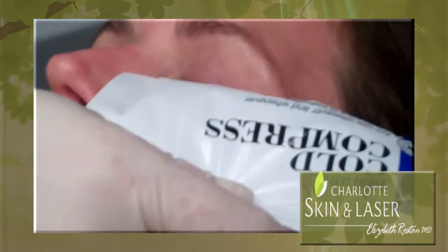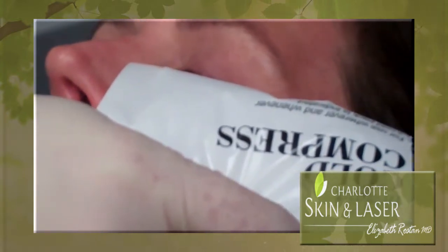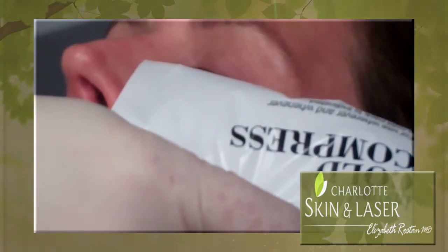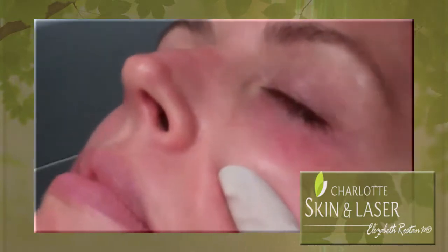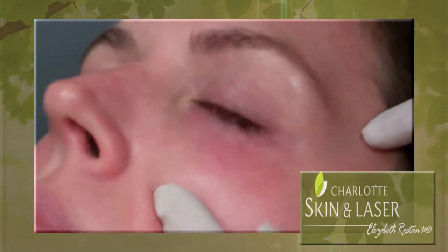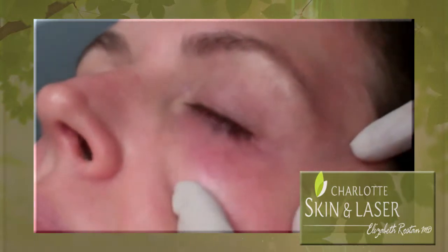We just take our time doing that. Unlike other laser procedures where it's zap, zap, zap, we have to take our time because this big target, once it gets heated up, can cause some damage to the skin. So this should only be done by someone who's very experienced in laser treatments and only with the correct protective eye gear in place.